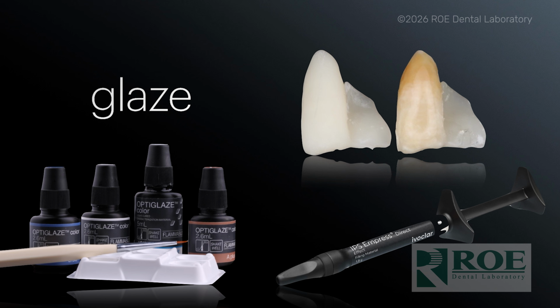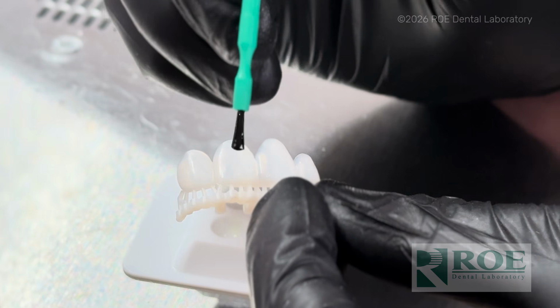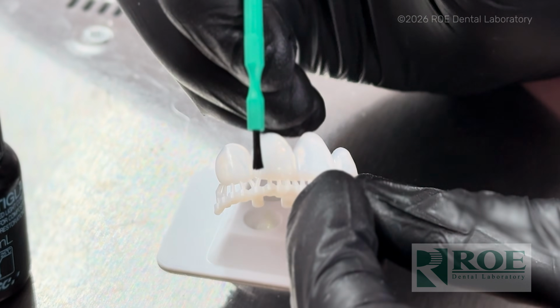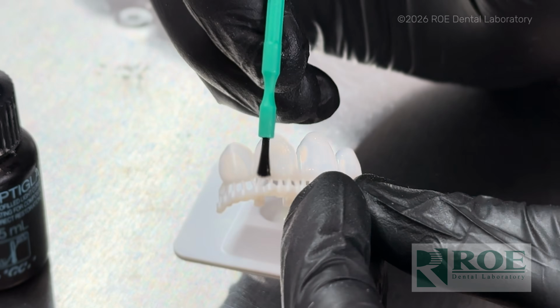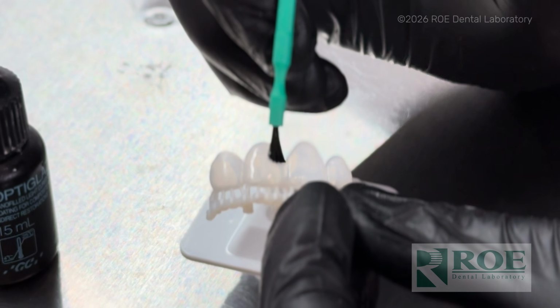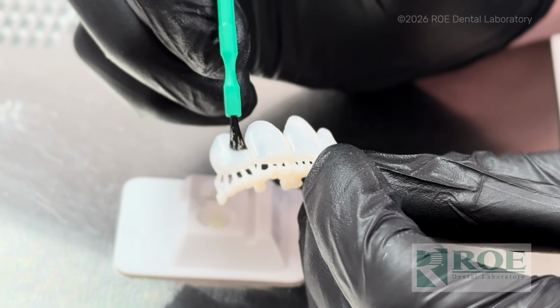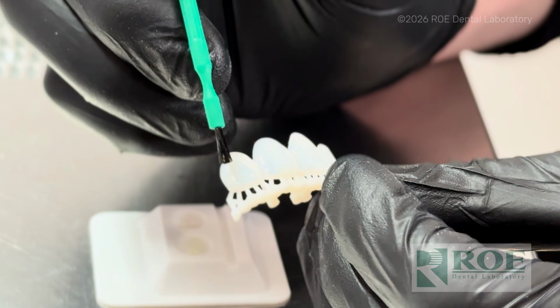You can also glaze things depending on the colors. Sometimes you got to make things fancy, right? You got to do it. My associate, Tom loves to make things look amazing. He's much better at this than I am because he practices it more. But what you're going to do is you're basically just going to take a dap and dish brush and just brush on some glaze. And the glaze can be, SprintRay's got a glaze, GC Optiglaze is good. You can use flowable composite. You just need some glaze that you can put on there to make it shiny.